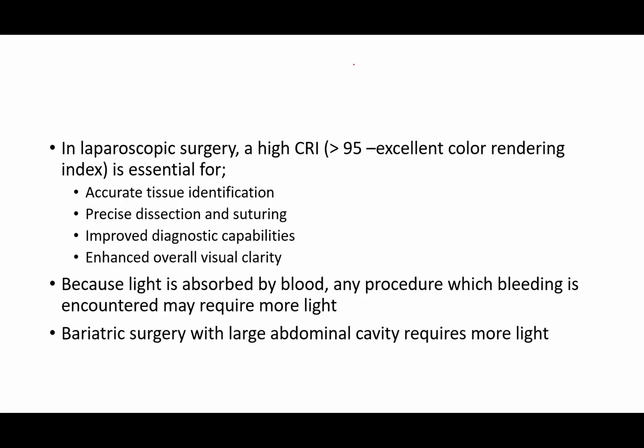You should never have any doubt when operating, okay? You should be able to identify a tissue and manipulate a tissue without any confusion or complication. There should be precise dissection and suturing, improved diagnostic capabilities, and enhanced overall visual clarity.